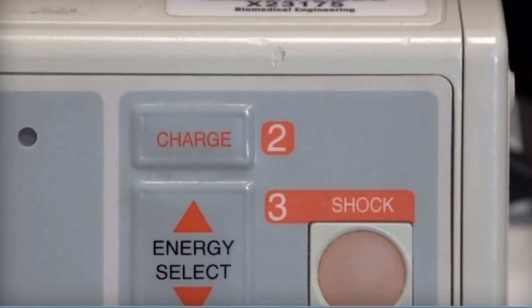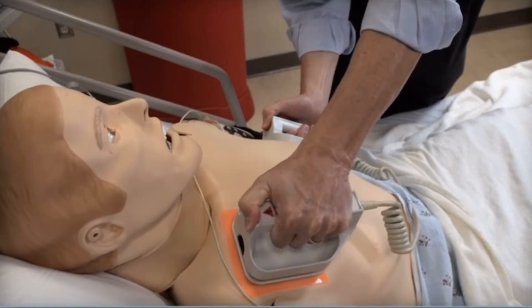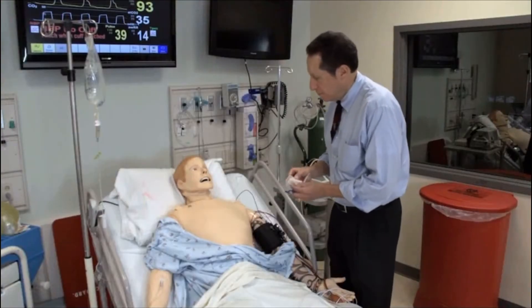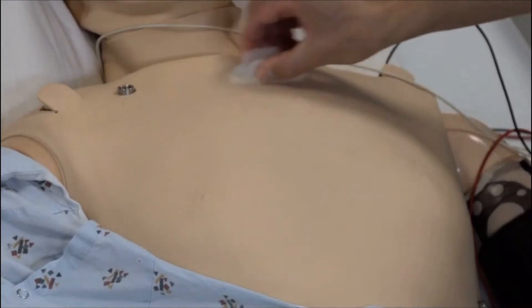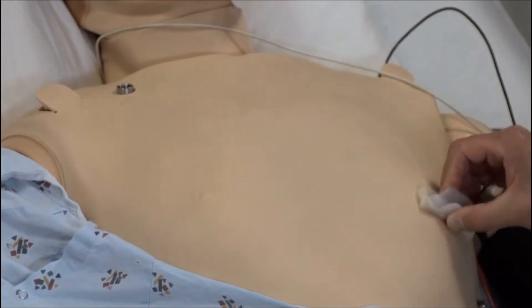The procedure can be done urgently or electively. If time permits, clean and dry the patient's skin. Shave or clip any hair to ensure good contact between the defibrillation pads or paddles and the skin.